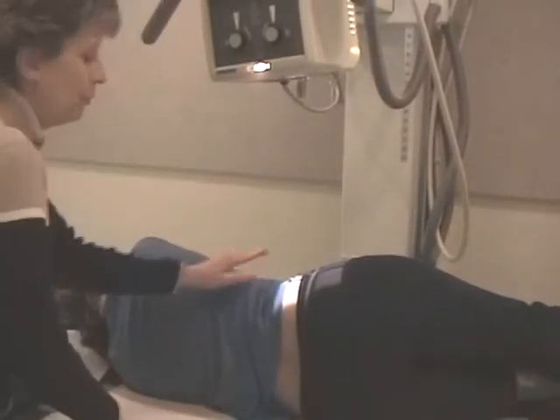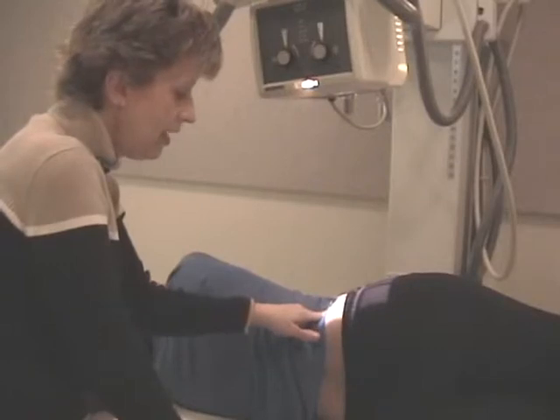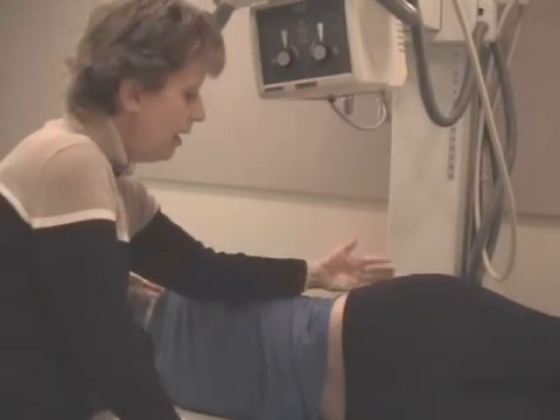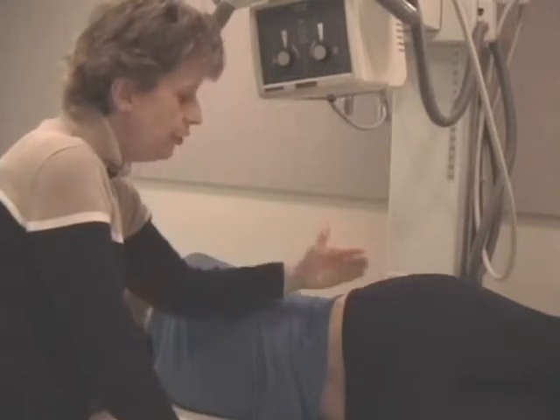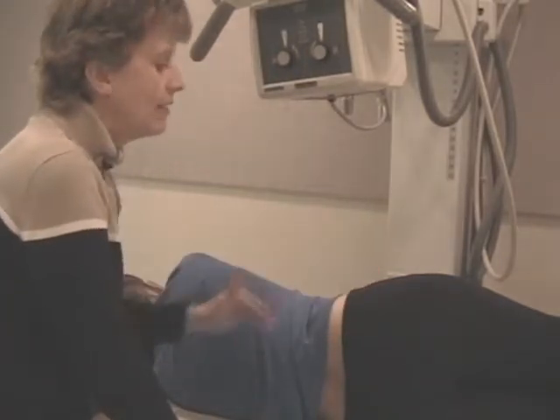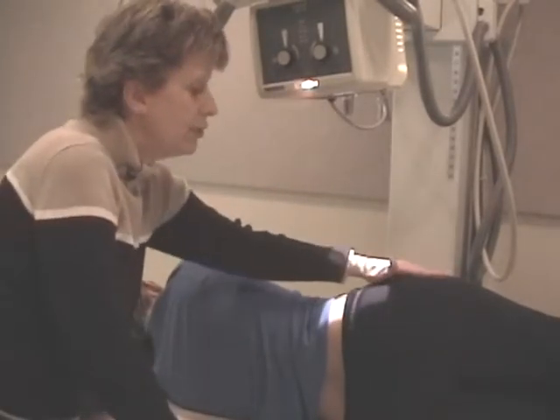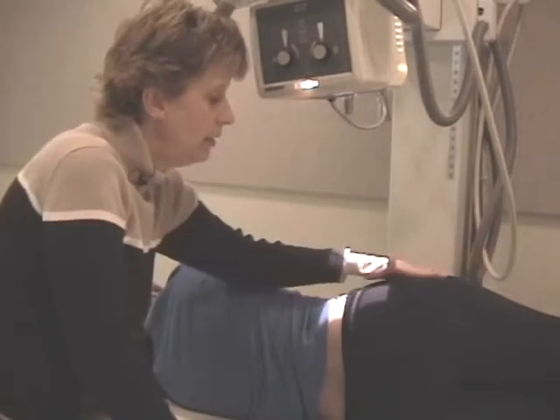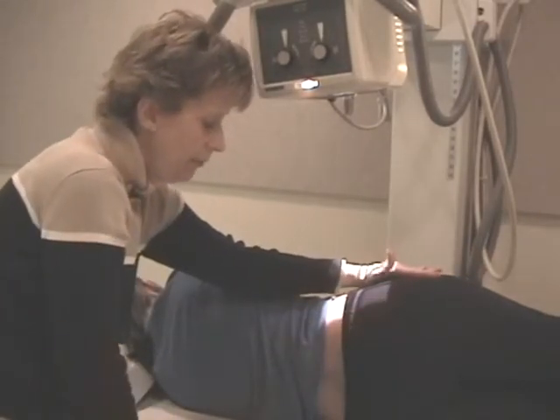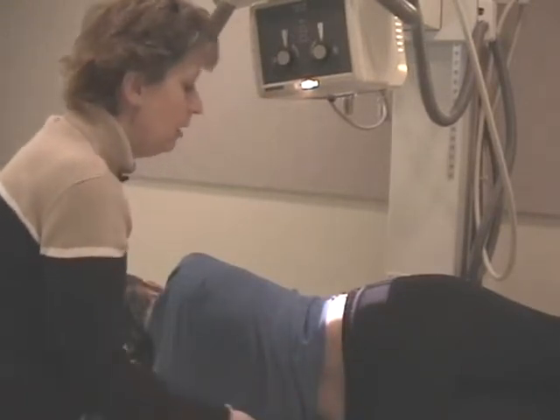Okay, let me review. Technically, to find the referencing, you use the iliac crest and you're 2 inches inferior to the iliac crest. ASIS, and you're 2 inches posterior. As a backup, in the field, you can find the patient's trochanter, flat hand, and this crosshair should be slightly behind the trochanter, and this crosshair would come down through the dimples.